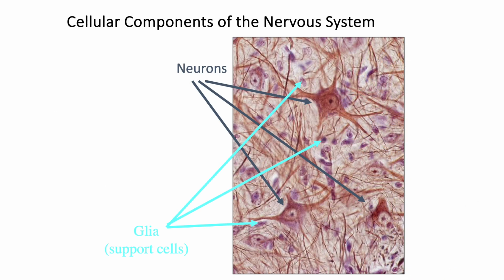In a histological micrograph, you need some special stains to pick up these neurons we just saw in the previous slide. So let's just transpose the understanding of the previous slides, which was just a drawing, to this micrograph. You can see that you have this region which is the cytoplasm with the nucleus. Okay, so the cell body is there. You can also see some extensions coming out of this cell body. So some of them will be dendrites and one of them will be the axon.